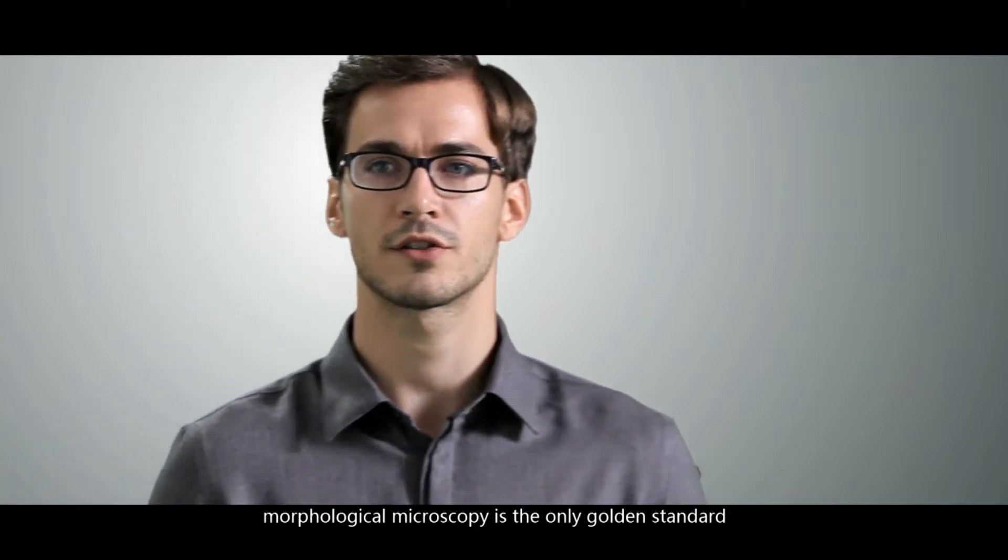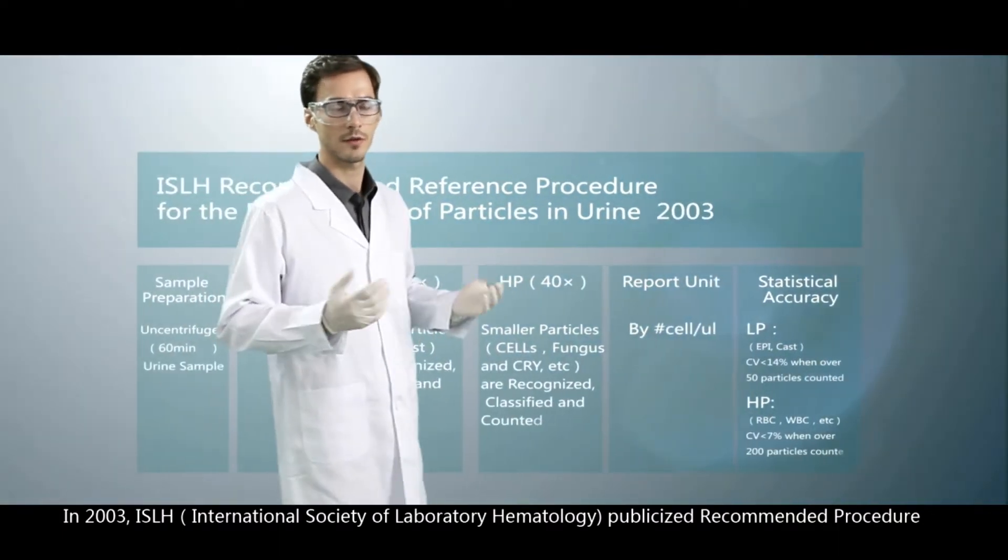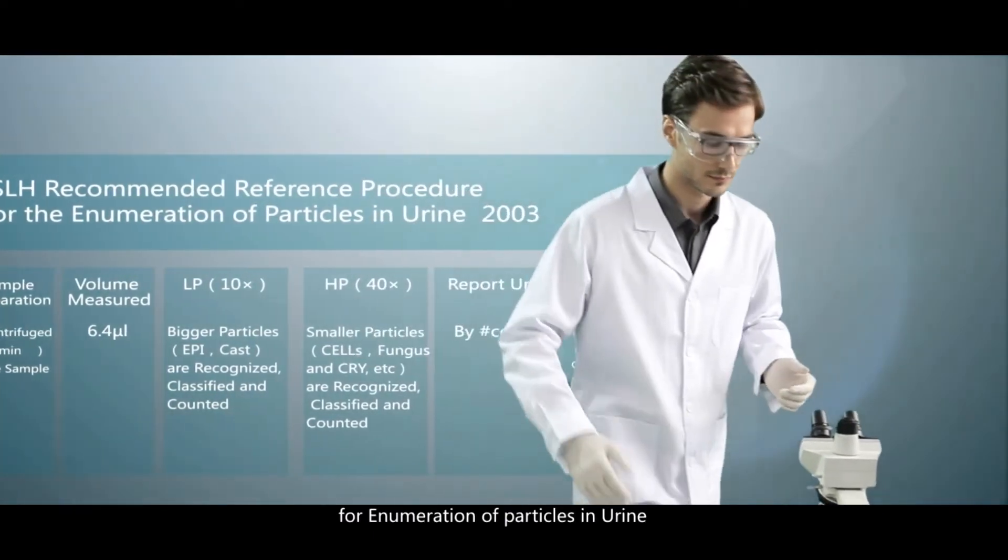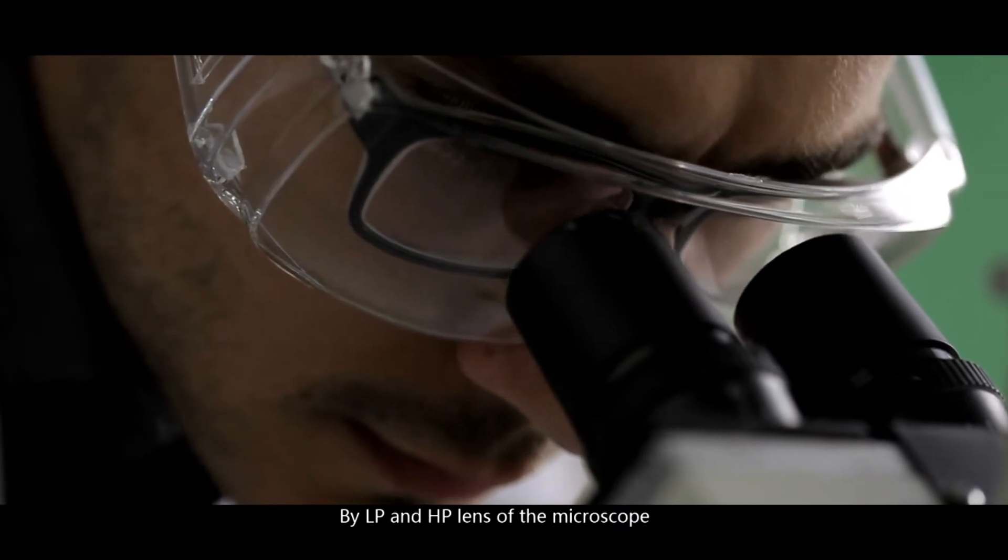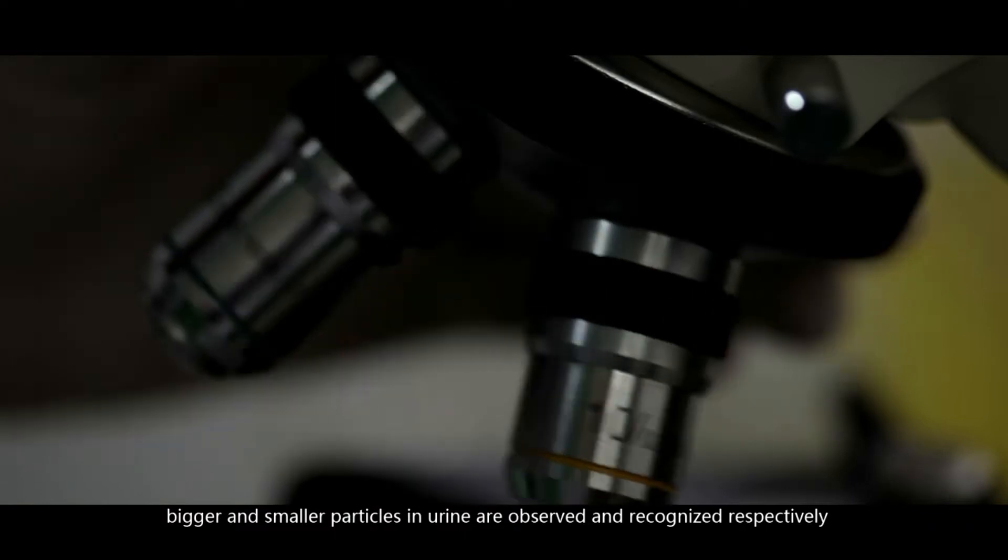Morphological microscopy is the only golden standard. In 2003, ISLH, International Society of Laboratory Hematology, publicized recommended procedure for enumeration of particles in urine. By low power and high power lens of the microscope, bigger and smaller particles in urine are observed and recognized respectively.